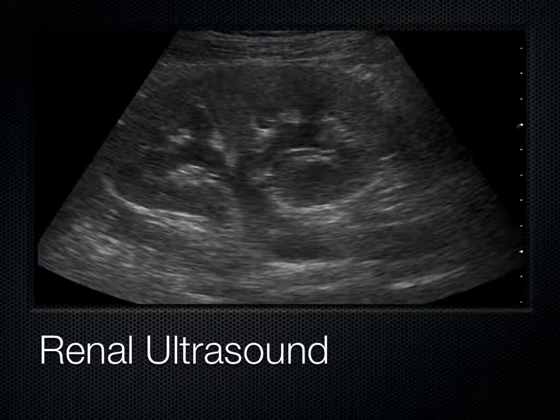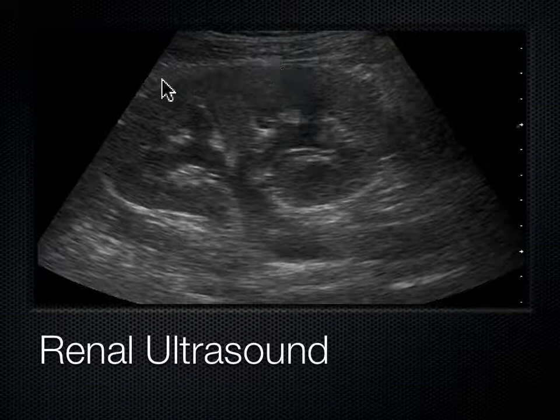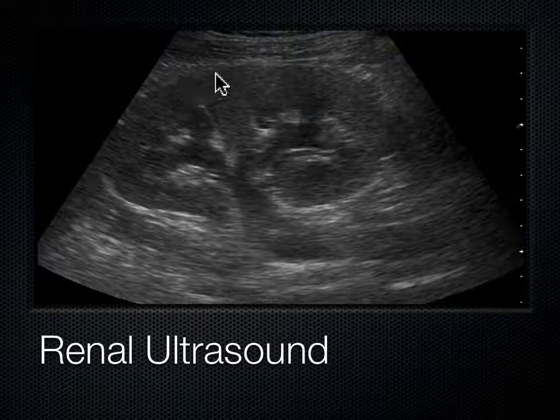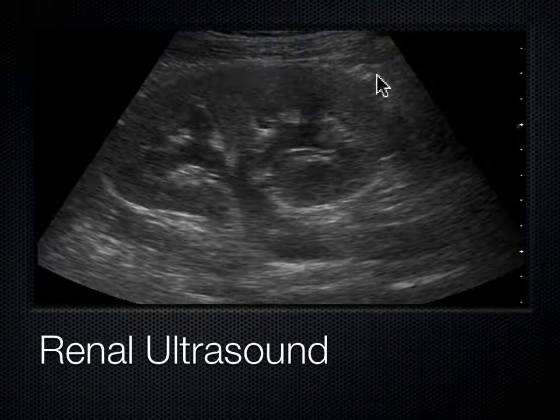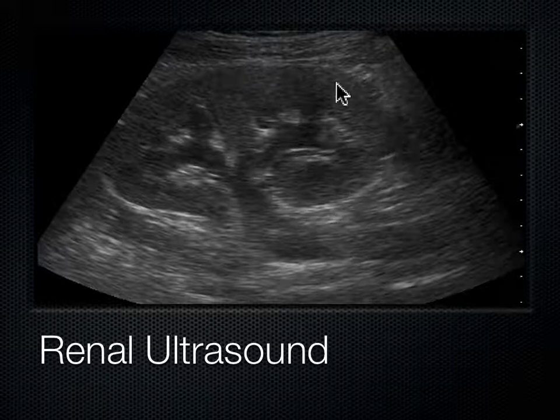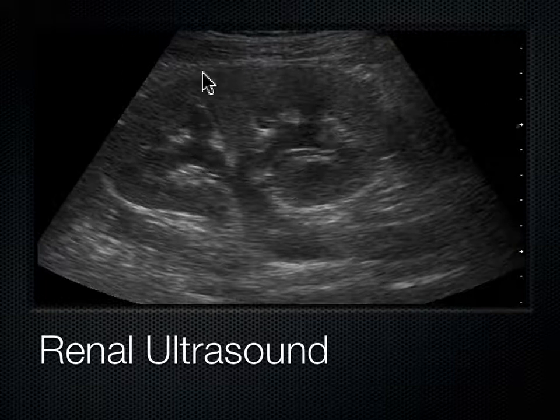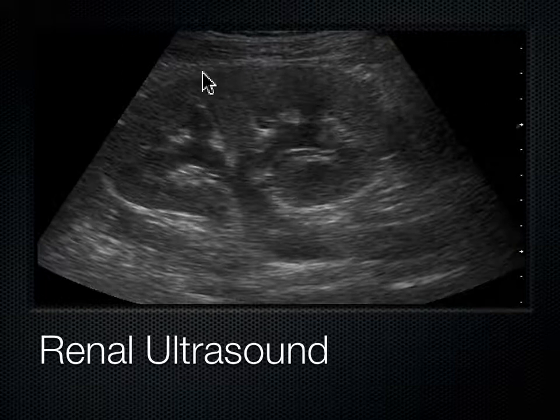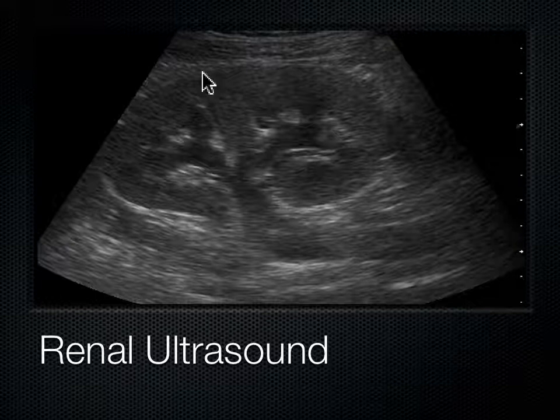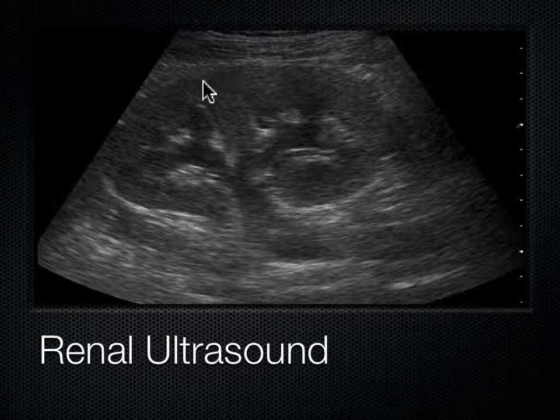You can tell from this image that this is a kidney. The kidney has some anatomy to it. This is the capsule of the kidney out here. It's a very thick fiber structure and the capsule does not allow the kidney to expand very much. So when somebody has a blockage like a kidney stone, there's really nowhere for the kidney to expand, and that's why people get excruciating colicky pain with kidney stones — because of this capsule.